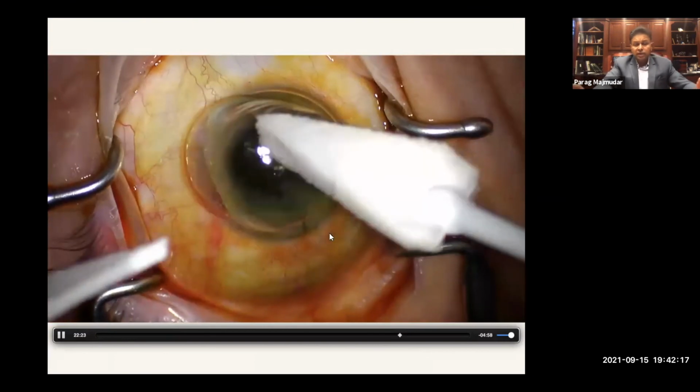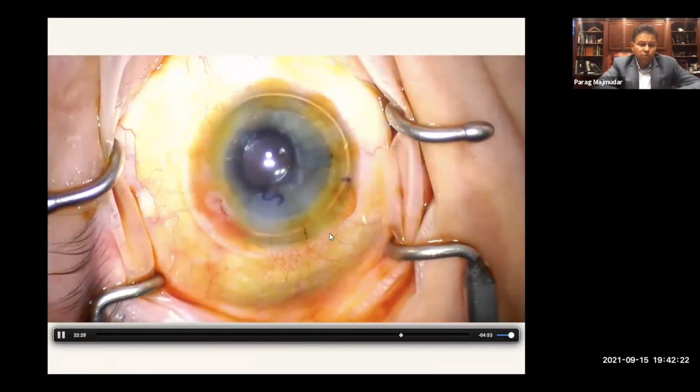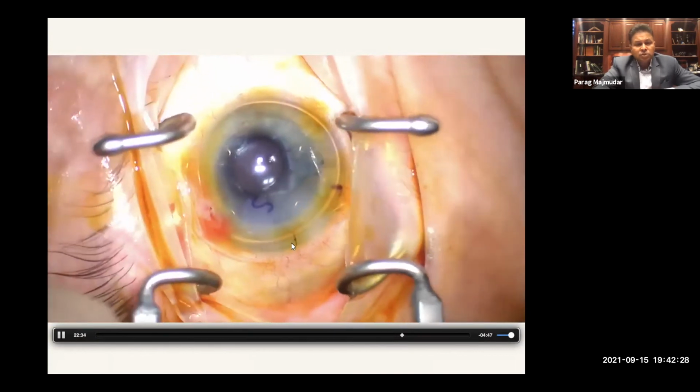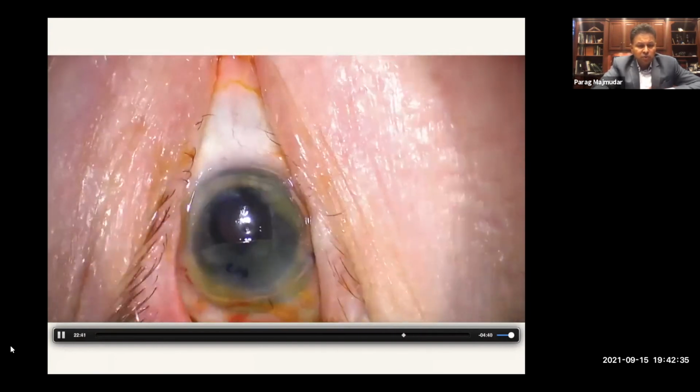And I know yesterday I had a new scrub nurse, and I think that there might have been an issue where the pressure went up because the concentration of the gas was just too high. But keep that in mind as you're doing this procedure, that those are things to watch for. But this is a great case. This patient ended up doing really, really well.